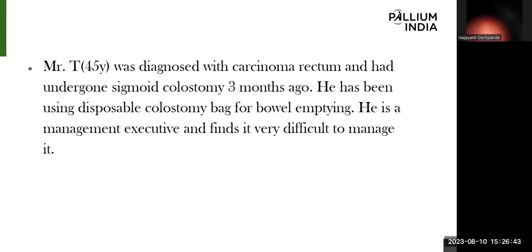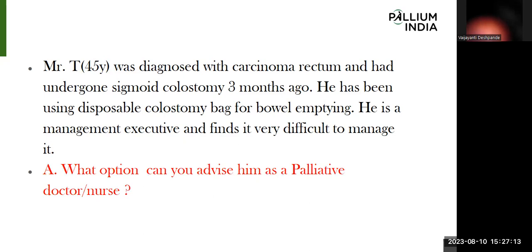Mr. T, 45 years, was diagnosed with carcinoma rectum and had undergone sigmoid colostomy 3 months ago. He has been using a disposable colostomy bag for bowel emptying. He is a management executive and finds it very difficult to manage it. What option can you advise him as a palliative doctor or nurse? This is the question.